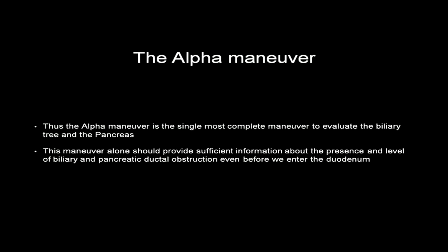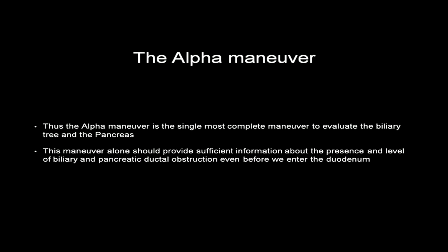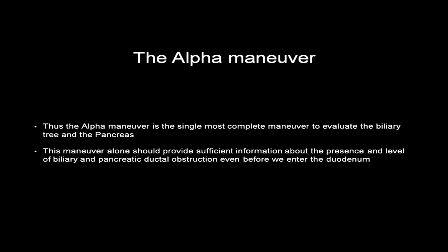The alpha maneuver is the single most complete maneuver to evaluate the biliary tree and the pancreas. This maneuver alone should provide sufficient information on the pancreas and the level of biliary and pancreatic ductal obstruction, even before we enter the duodenum.